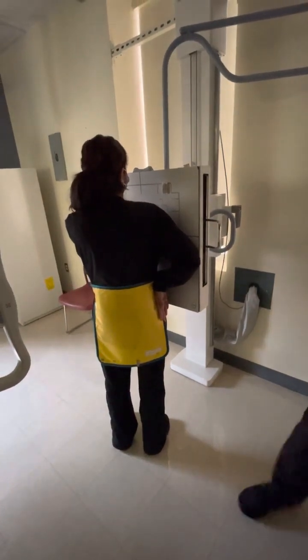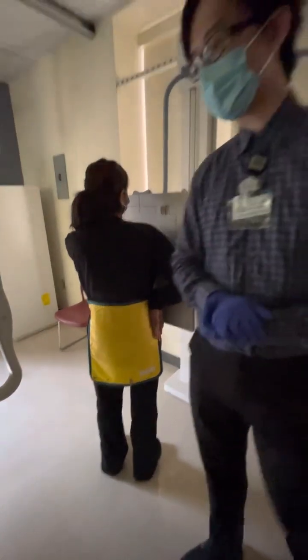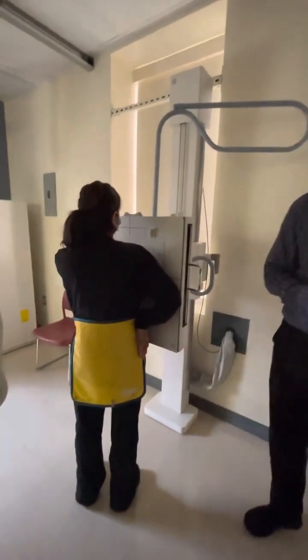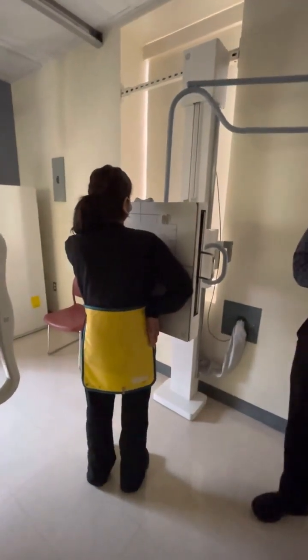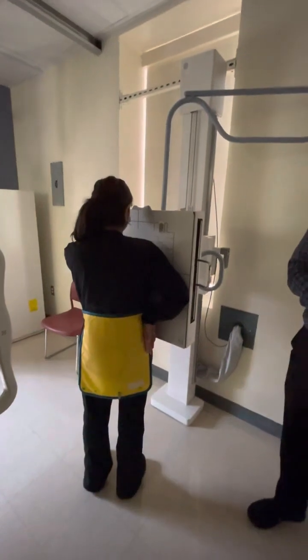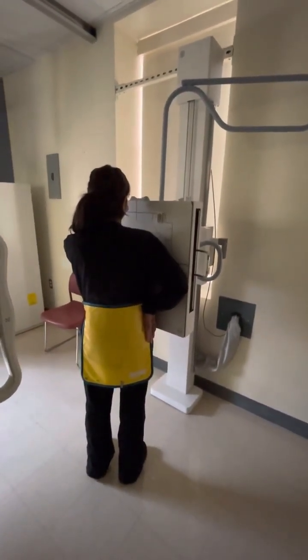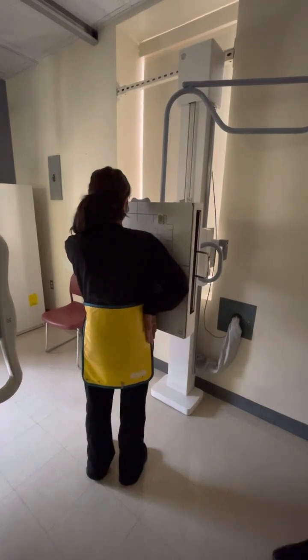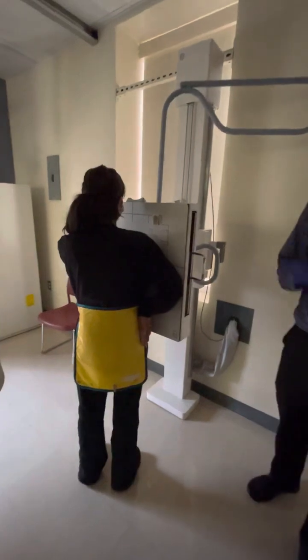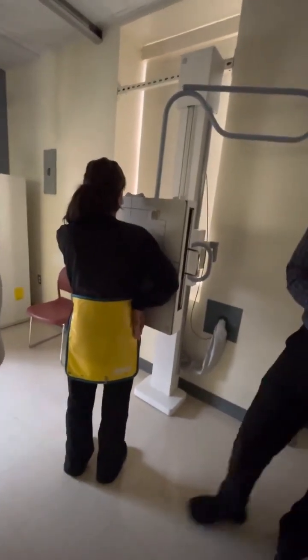Okay, right now, because this is upper ribs, what are my breathing instructions? Same thing as the chest. So what is that? Take a deep breath in. Let it all the way out. Take another deep breath in. Hold your breath. X-ray. And you can breathe. Very good. So once again, upper ribs, we do this on inspiration when they breathe in.